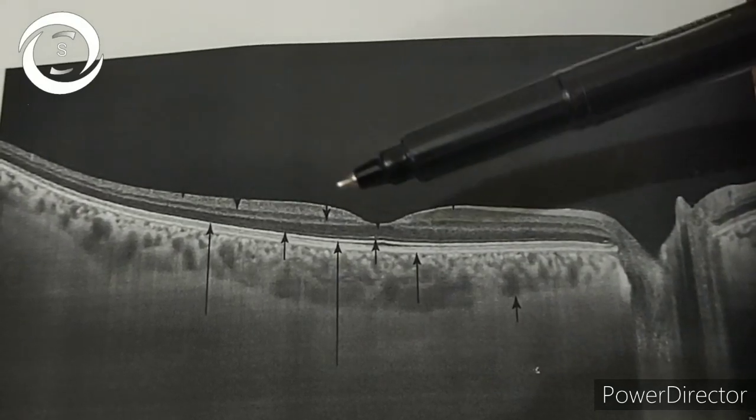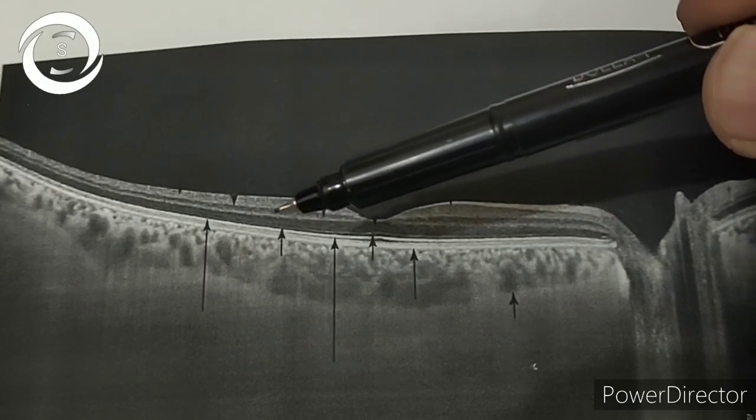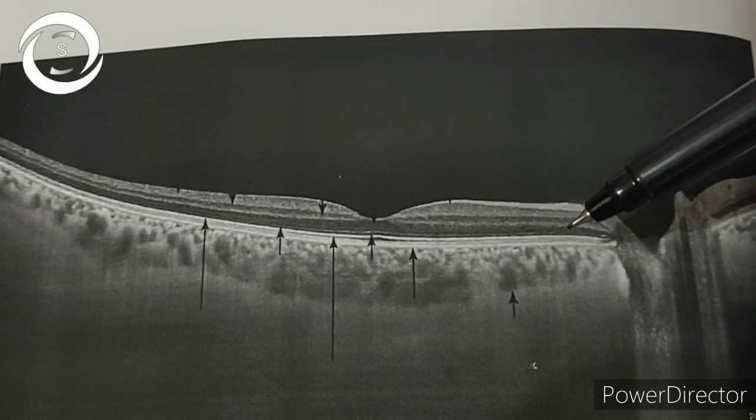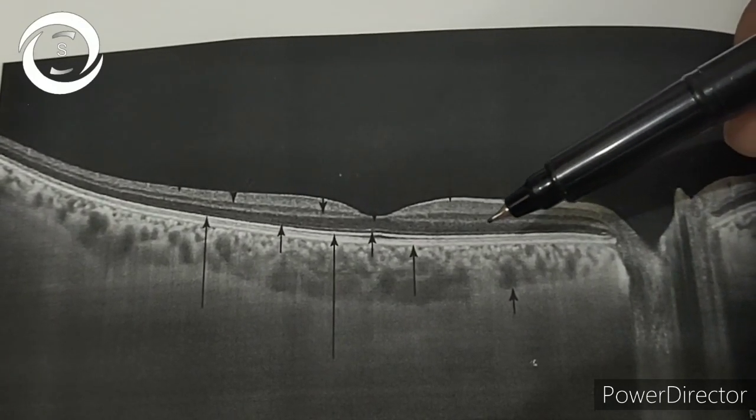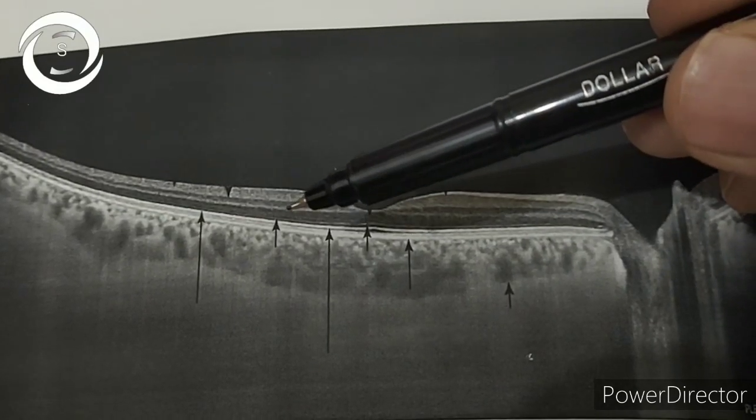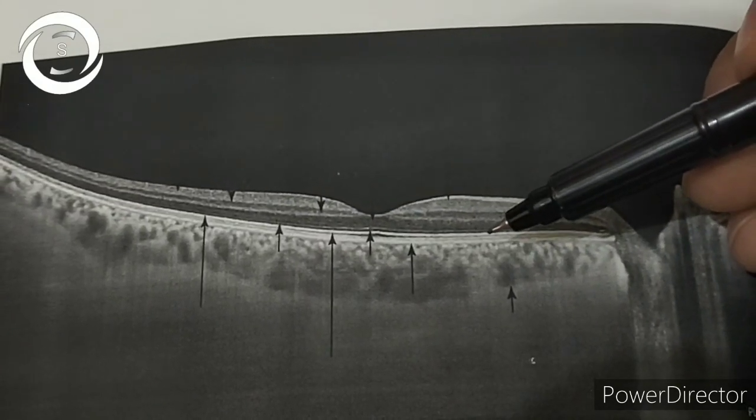Beneath the internal limiting membrane, the hypo-reflective layer in this swept source OCT is the ganglion cell layer. Then the more hyper-reflective layer is inner plexiform layer. Underneath it is hypo-reflective inner nuclear layer, then the outer plexiform layer.